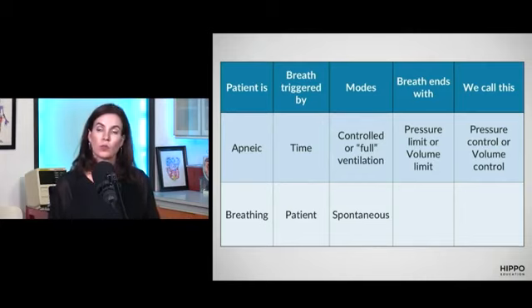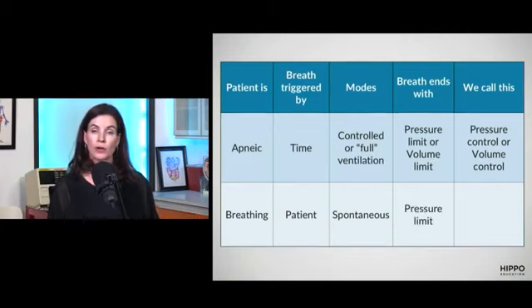Or some places will even call this assist control ventilation, which is one of the other terms for this. And most centers will use either one or the other routinely, and so you'll get comfortable with seeing that used on a regular basis, because these are probably our most common modes that we're setting initially. For the patient who's breathing spontaneously, the breath typically ends with a pressure limit.